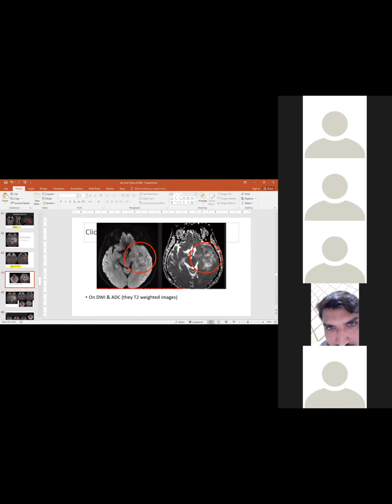And in subsequent lectures, if given the opportunity, inshallah, we'll do these. What is this DWI? What is this ADC image? And on these DWI and ADC images, we can appreciate this pathology affecting the left temporal horn of that lady.